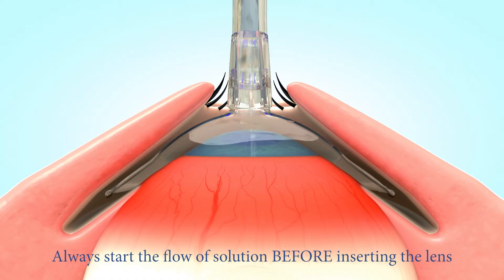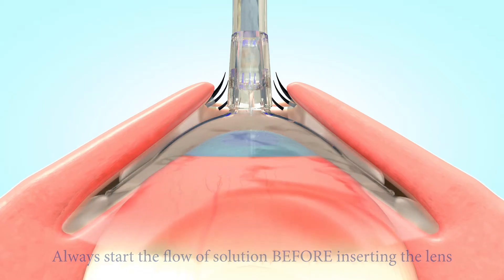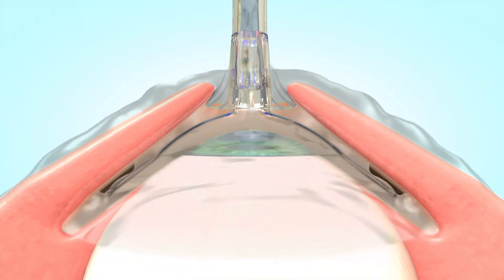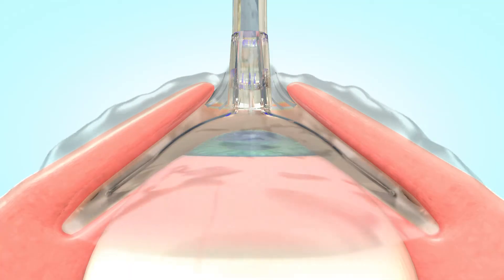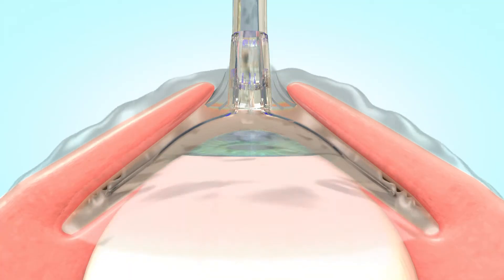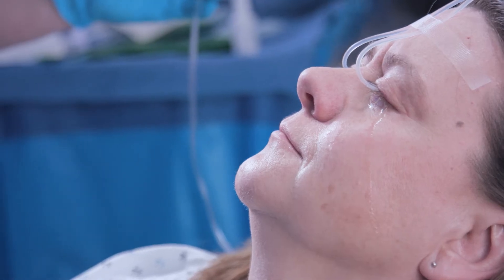Once inserted, the Morgan lens floats on the very layer of solution it provides. Designed to fit the natural curvature of the eye, the lens protects the tender ocular tissues and vaults the cornea, never touching it. As the lens floats above the eye, preventing further damage from eyelid movement, the flushing process soothes the eye and provides instant relief to the injured tissues.